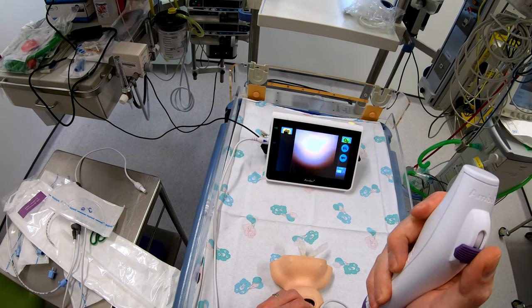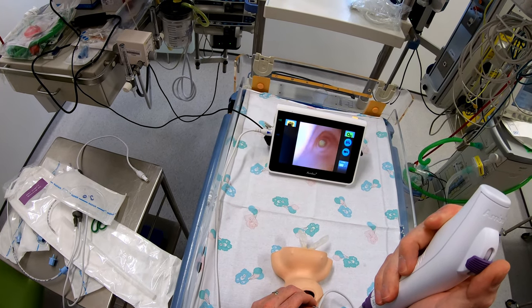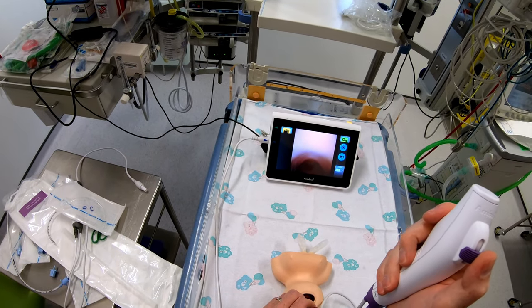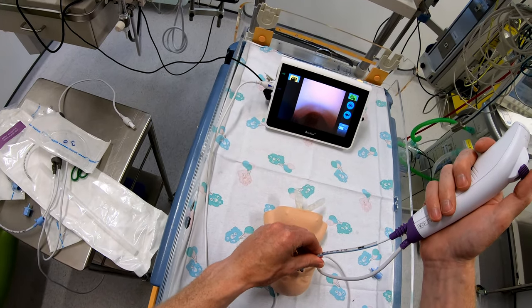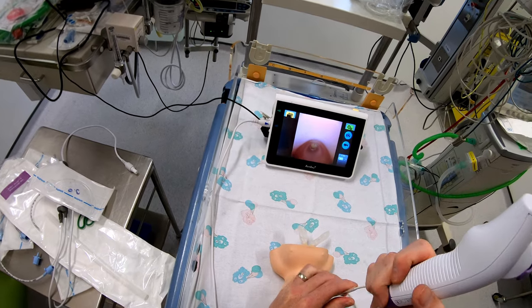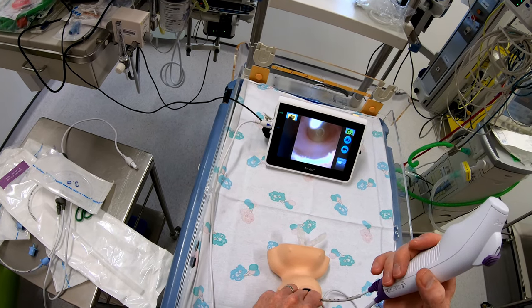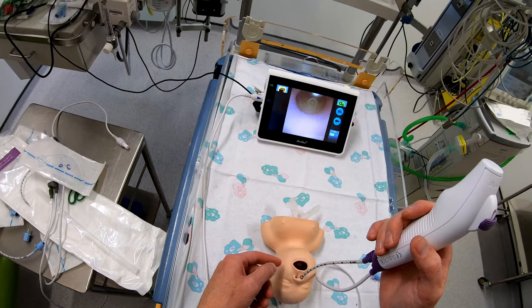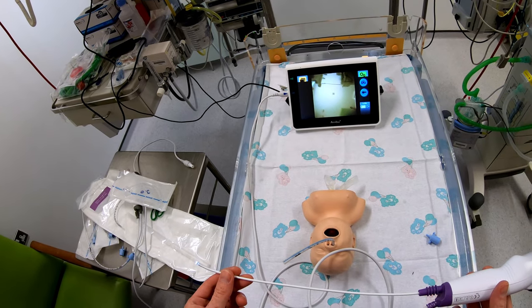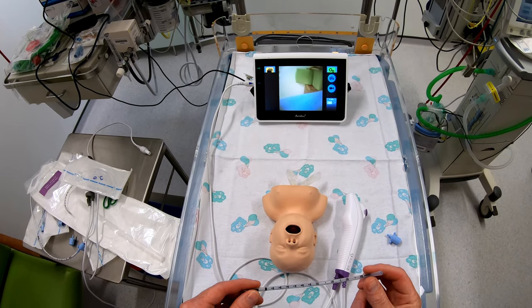There's the laryngeal opening. I'm not down as far as I would like to be. I cannot get the scope down to where the carina should be given where the tube is positioned. If I advance the tube in a little further I can then feed from the top, but that's not the correct technique. When I'm at the right carina depth, everything is in the nose and I'm struggling to feed it. So although this works from a diameter point of view, lengthwise it would be nice to have it a little bit longer.